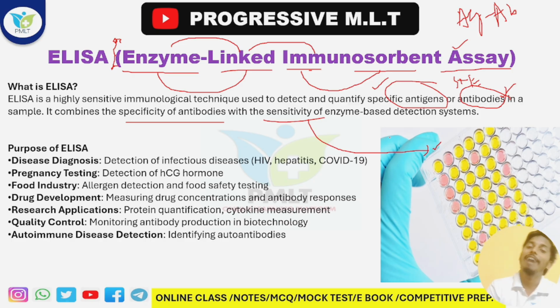Up to this much, we have understood that we have to link the enzyme, use the substrate, and the antigen-antibody reaction will occur. We have understood that we can detect the antigen and the antibody. Okay. Now I'm coming to the purpose.